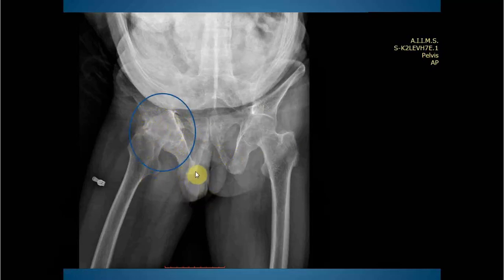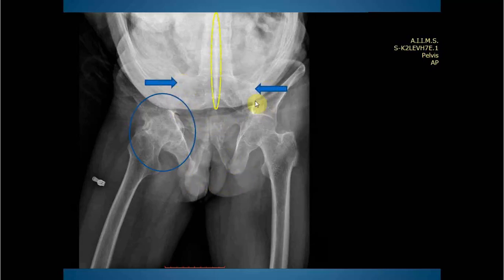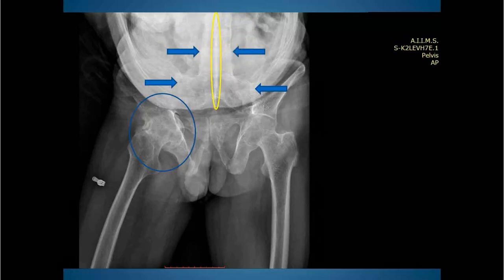There is fluffy periosteal ossification involving the bilateral ischial tuberosity, known as whiskering. There is ankylosis of bilateral sacroiliac joints. There is ossification of the interspinous and supraspinous ligaments giving an appearance of the dagger sign, fusion of multiple vertebral bodies due to ossification of the annulus fibrosus forming syndesmophytes, ossification of the ligamentum flavum, and fusion of the facet joints.